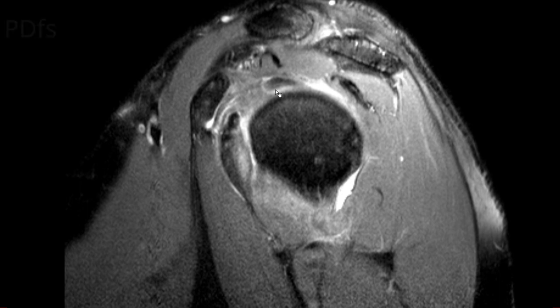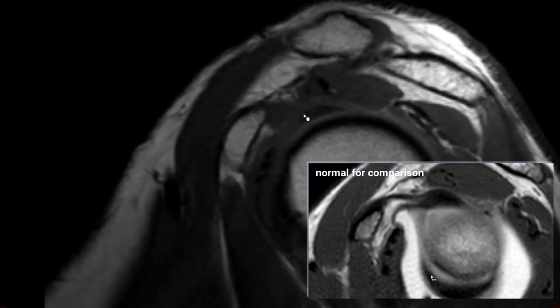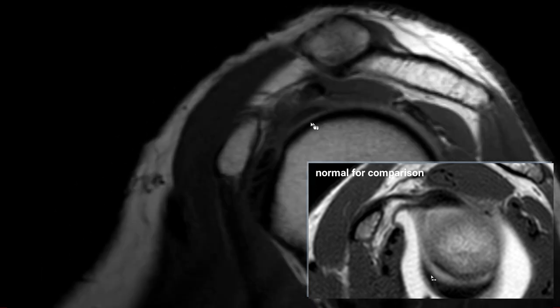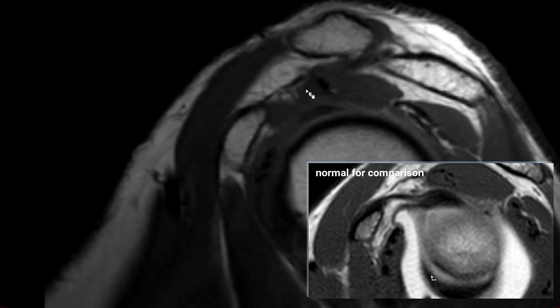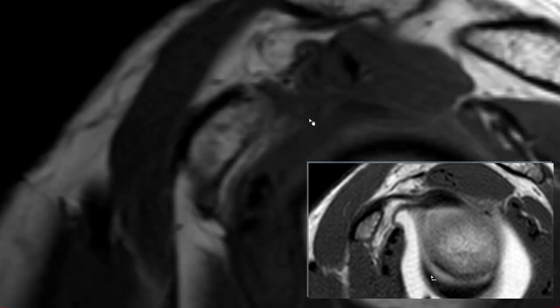On the PD fat-sat sagittal, you can again see edema around the axillary pouch and a slight edema in the rotator interval. On T1, since there's no IV gadolinium, there is no enhancement in the rotator interval — but clearly there is no fat either. The long head of the biceps tendon is visible, along with the supraspinatus, subscapularis, and coracoid process, but where we should have fatty tissue there is only muscle-isointense signal — this is obliteration of the fatty tissue in the rotator interval.